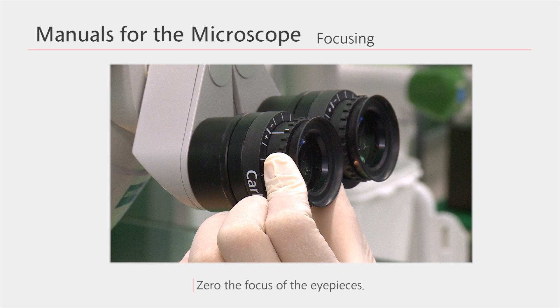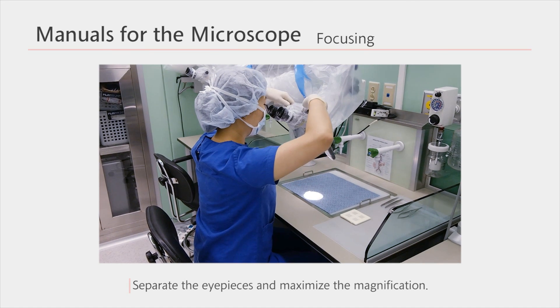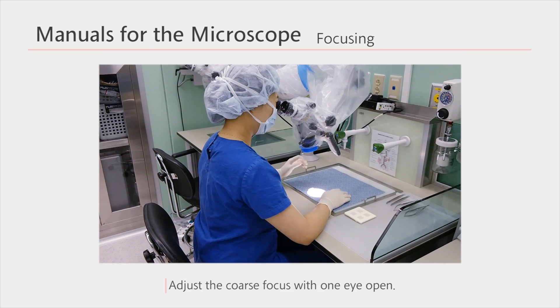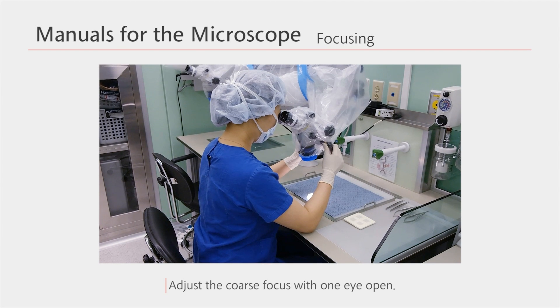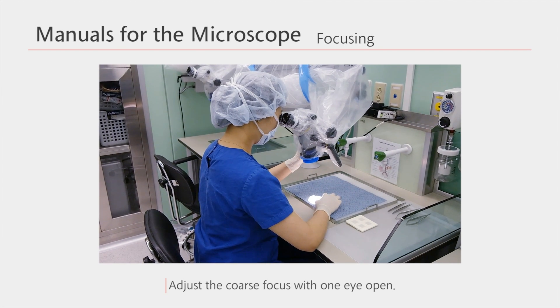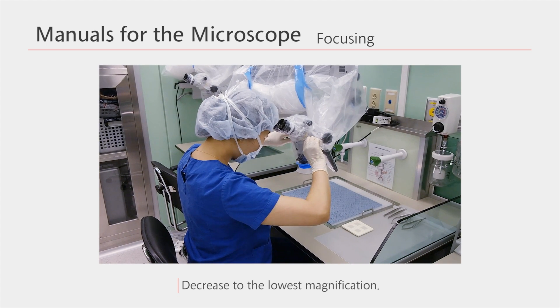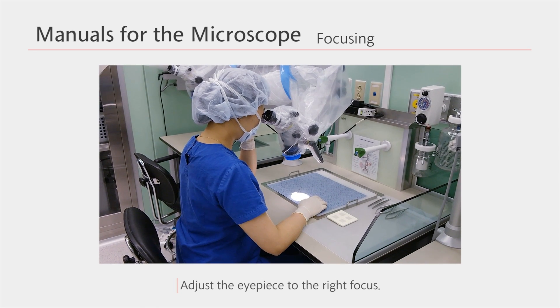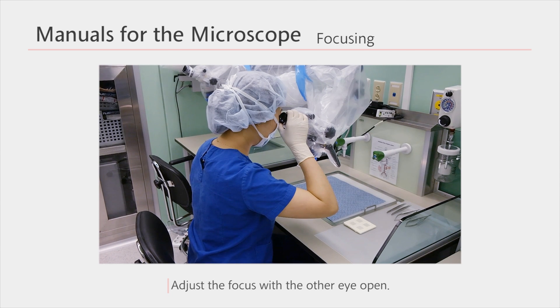How to adjust the focus is as follows. If you have normal eyesight, adjust the focus of the eyepieces to zero. Separate the eyepieces as far as possible from each other and increase to maximum magnification. With one eye closed, place the other eye on the eyepiece and adjust the coarse focus which moves the stage up and down. If the focus is right, do not move the stage anymore. Decrease the magnification to the minimum. Adjust the eyepiece until the focus is right. Now we're done with focusing one eye.